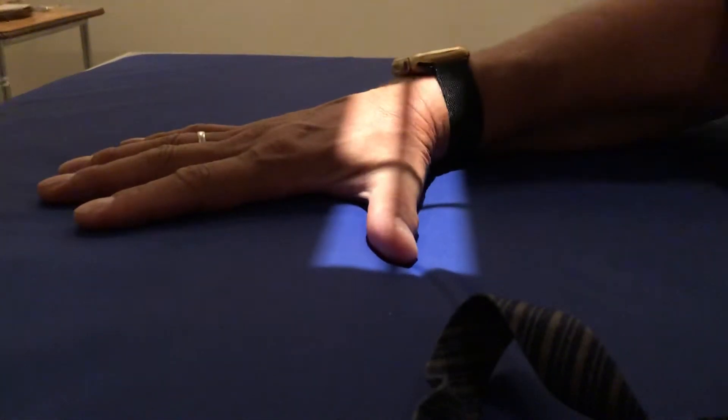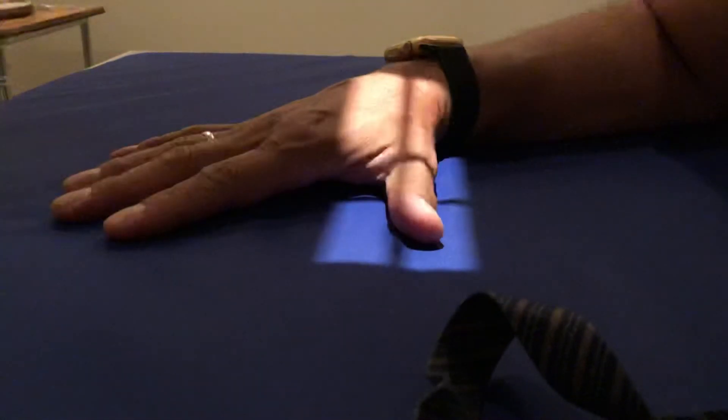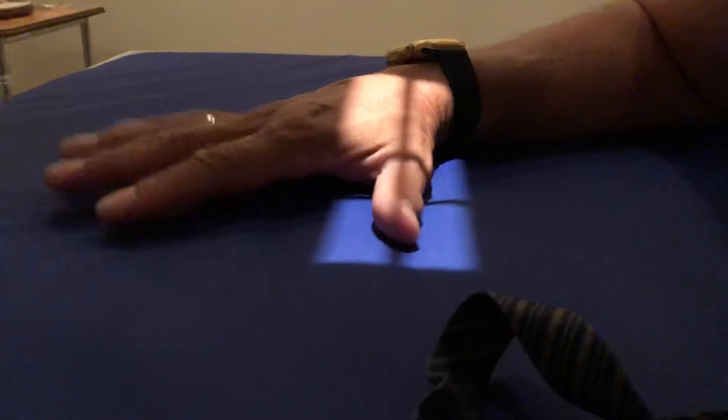Hi, you clicked on this link because you want to know how to take an x-ray of a thumb, and I'm going to show you how to do it perfectly every time.